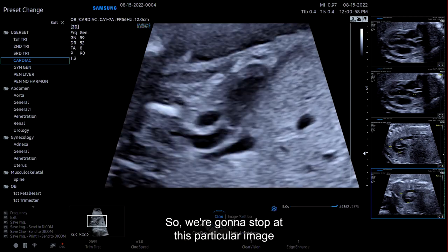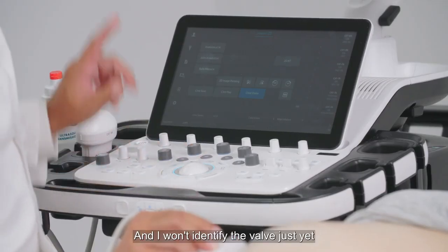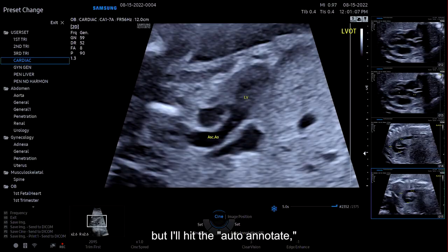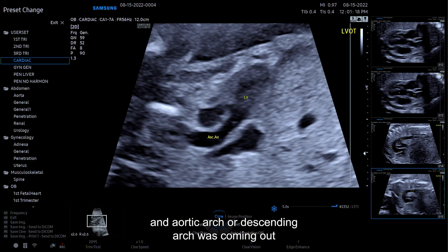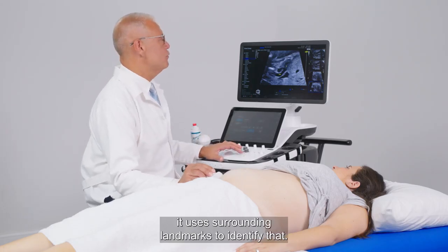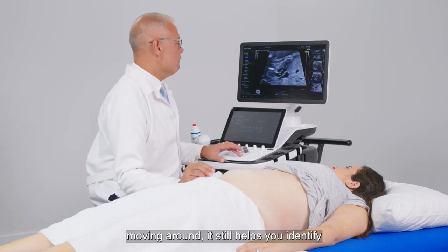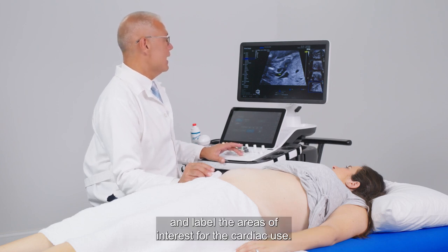So we're going to stop at this particular image, right? Making sure that you can see the valve there, and I won't identify the valve just yet, but I'll hit the auto annotate, and you can see, even though compared to the previous image where the left ventricle was in the completely opposite side and the aortic arch, or the ascending arch, was coming out of the different direction, it was still able to identify that. So once again, it doesn't matter about fetal position, it used the surrounding landmarks to identify that. So that's a perfect example, as even if the baby's moving around, it still helps you identify and label the areas of interest for the cardiac views.